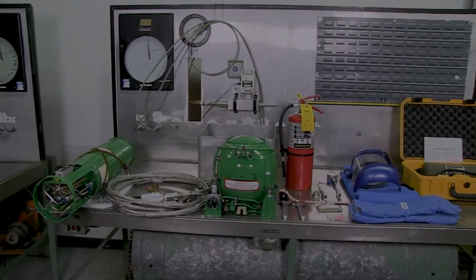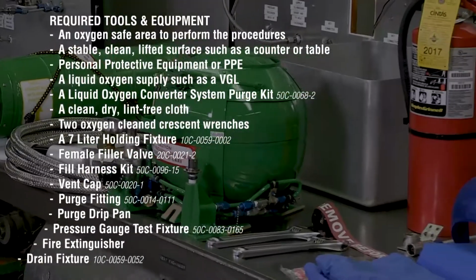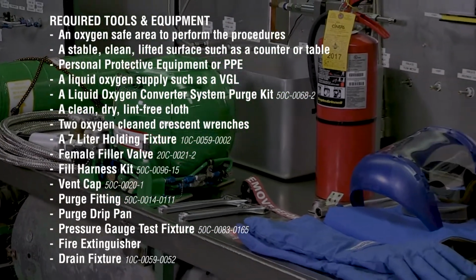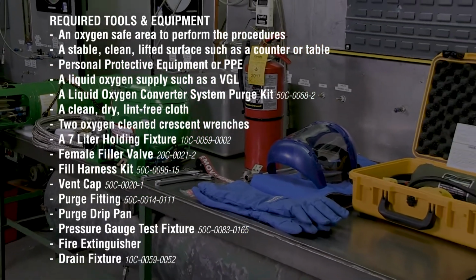To prepare for troubleshooting, purging, and testing 7-liter and 10-liter LOX converters, it is a good idea to first gather all of the required tools and equipment that will be needed for each procedure.